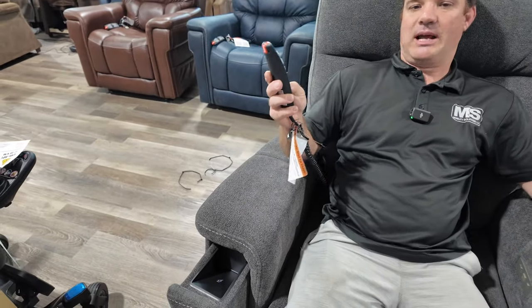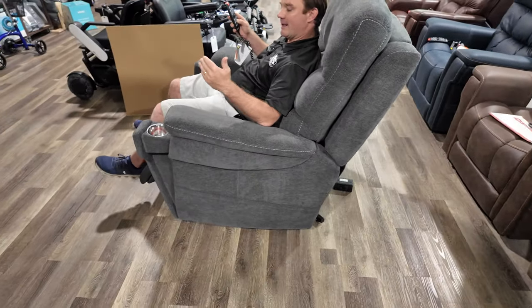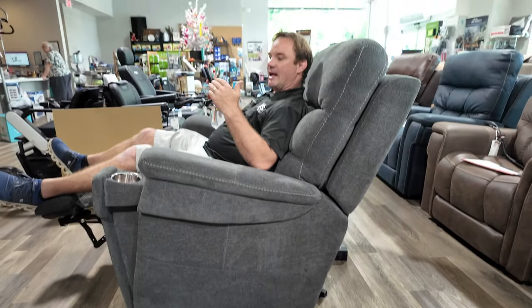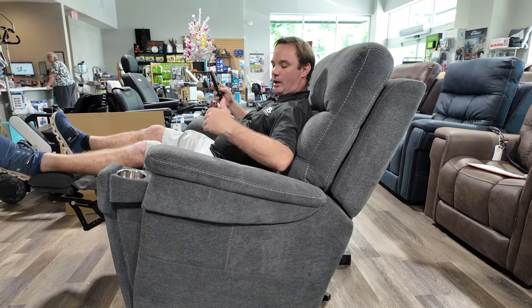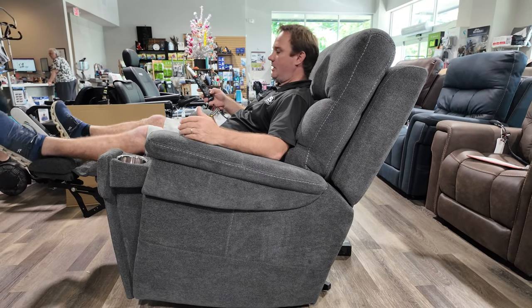If this one is a little too expensive for you, they also make the PLR3955, which is not going to have the lumbar massage or the tilt, but it does have heat and does everything else this one does.